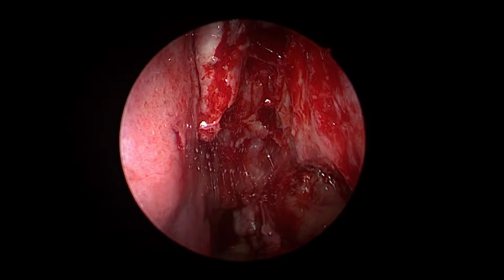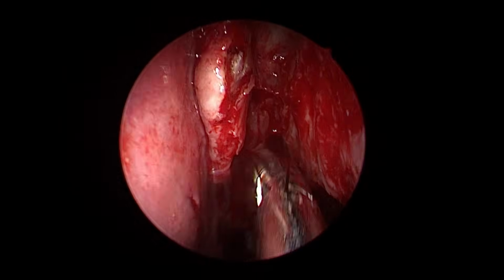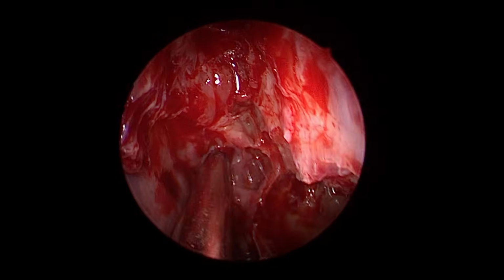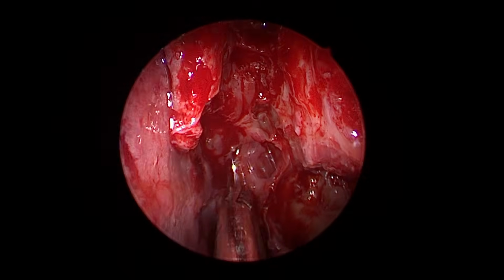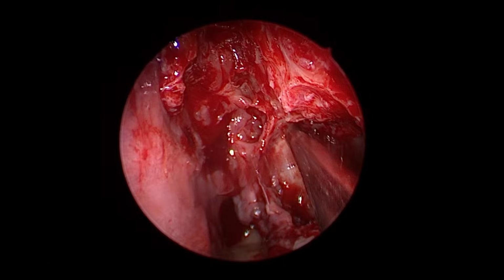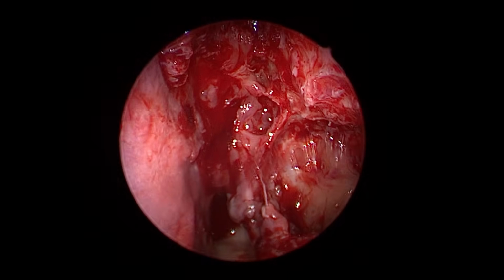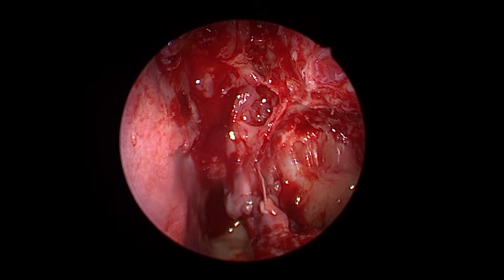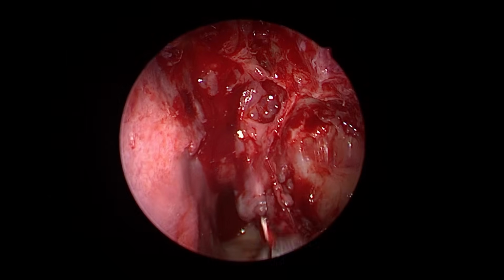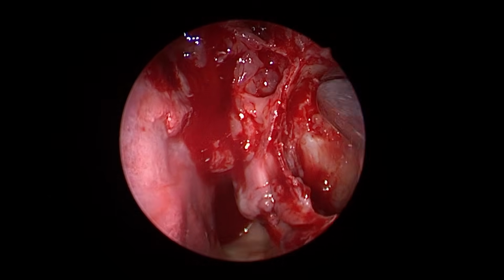Now, reaching the post-ethmoid, I can go behind the anterior ethmoids and reach the post-ethmoids. But my concern is how deep I should go, whether I may hit the carotid artery or optic nerve. So many concerns while doing post-ethmoidectomy, because I need to stop while reaching the sphenoid. So how to assess that? What I will do, I will first open the sphenoid and reorient myself.